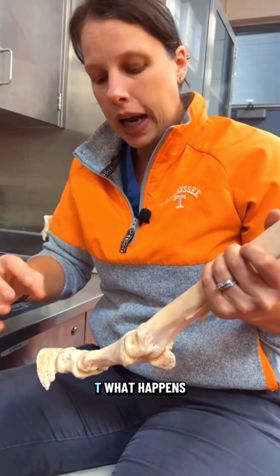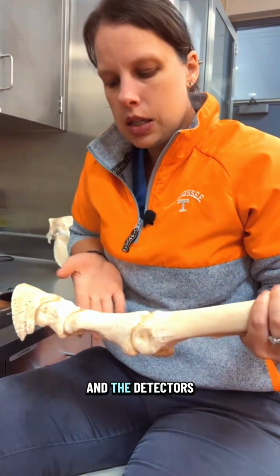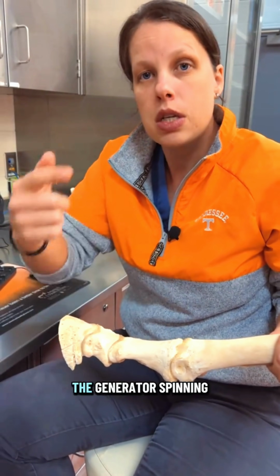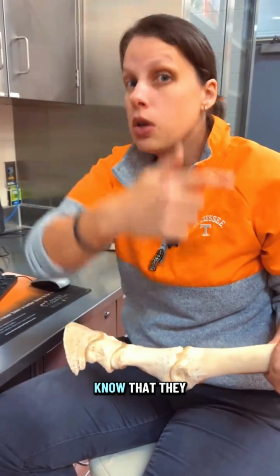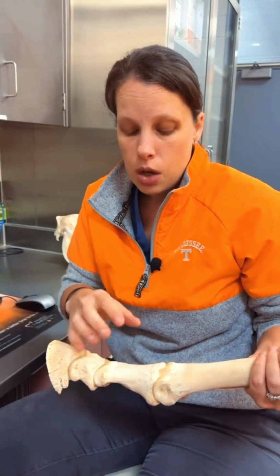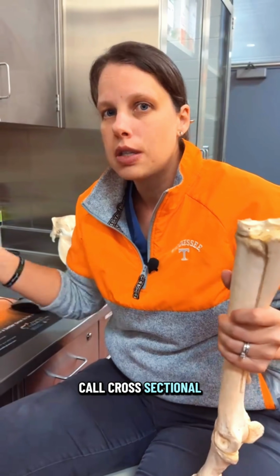For a CT, what happens is it sends the x-rays in slices, and the detectors are also in slices. So when we appreciate what happens on the other side of the leg, not only is the generator spinning around the leg or spinning around whatever's in there. If you've been in a CT, you kind of know they call it the donut of truth. And so the generator and the detector plates are both spinning around you, collecting information constantly. So that's why it's really helpful to get these slices that then we call cross-sectional imaging.